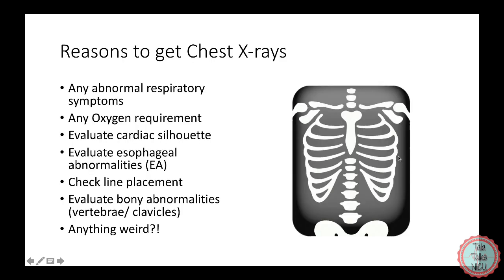So let's start with this. When do we actually get an X-ray in the unit or in babies generally? Well, as this slide lists, there's lots of different reasons we get X-rays. Remember, this is a brand new patient in the world, and however good the OBs have gotten at identifying stuff that's gone wrong prenatally, we can always be surprised.